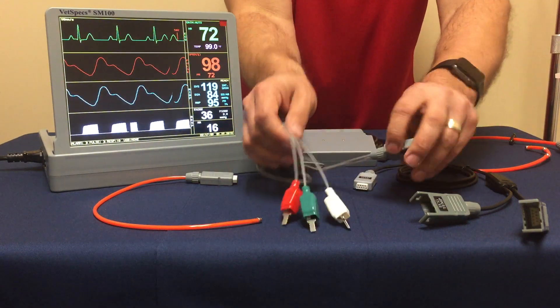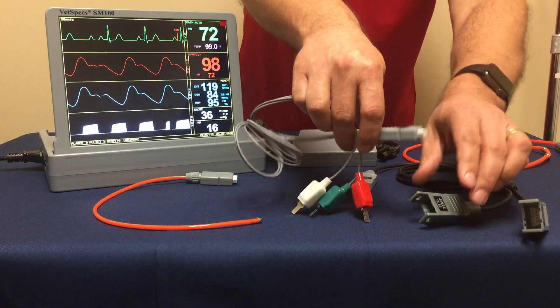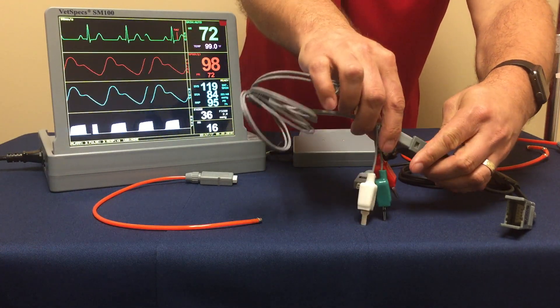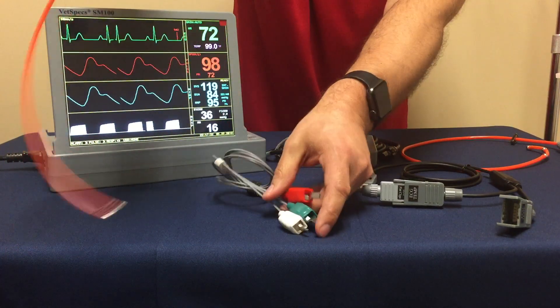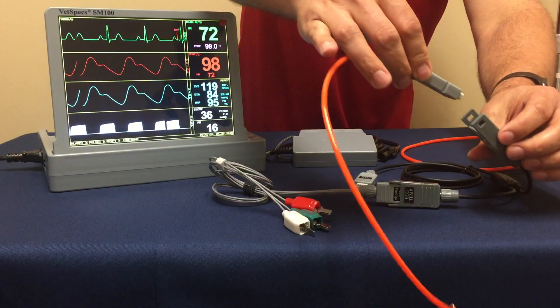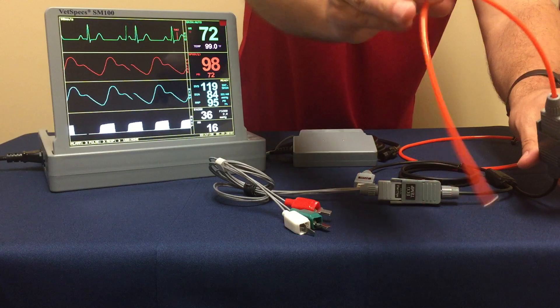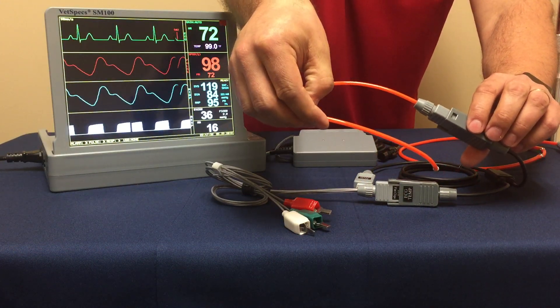You then apply the VetSpecs ECG flat clip leads and connect them into the port. This gives you your ECG function right to the patient's body, and then you connect your rectal temperature probe to the other Y connection at the rear of the patient for rectal temperature.